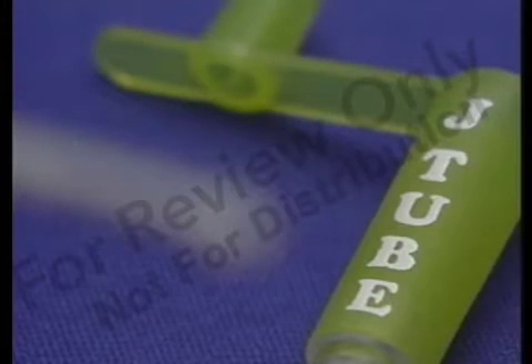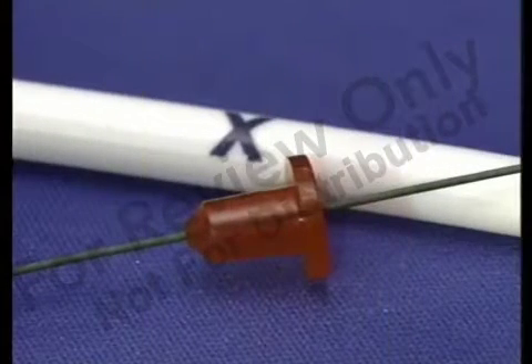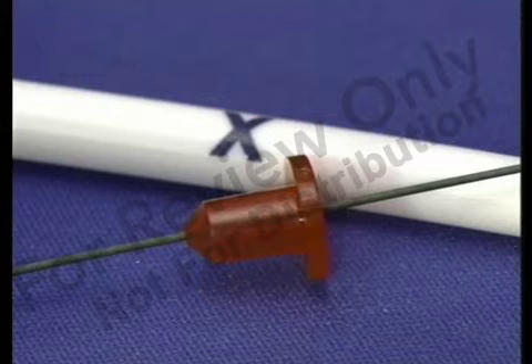A unique tapered tip and radiopaque stripe simplifies tube placement. The GJ tube features an open flow tip which allows excellent formula flow into the jejunum. An air plug is secured over the PEG 24 to minimize air leakage during placement.